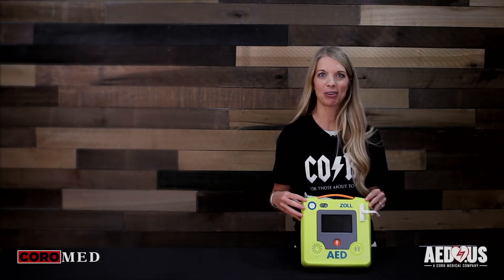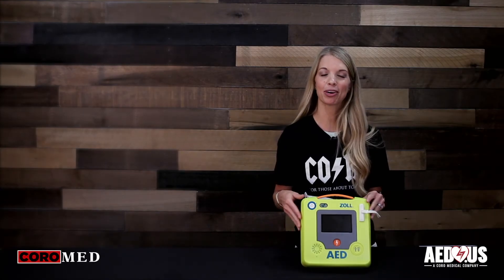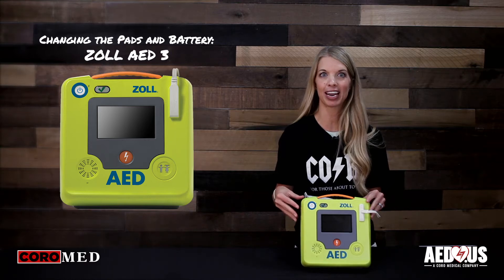This is Blair with Coro Medical, home of AED.us, and today we're going to go over how to change the pads and battery in the Zoll AED3.